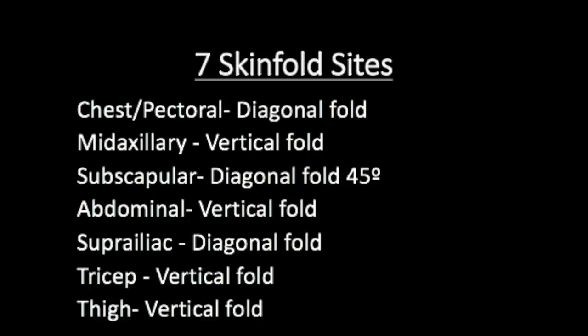You should avoid obtaining measurements immediately following exercise. The purpose of this assessment is to determine body fat percentage by measuring subcutaneous fat skin fold thickness. After obtaining all 7 skin fold sites, you will use a generalized skin fold equation to determine body density.